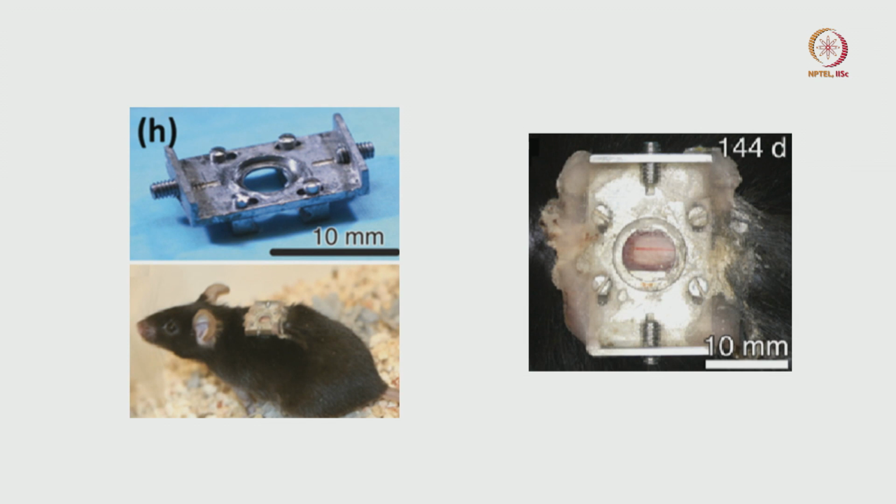You can also create various spinal windows similarly, but one needs to design this particular plate that needs to be fixed on the bony structure. You can see the screws there, and then you will pour the dental cement on the side. So this sort of metal frame is required to keep the cranial windows as well as spinal windows if your study requires the repeated sampling or repeated delivery of the drug, or anything that requires a chronic extension of the study.